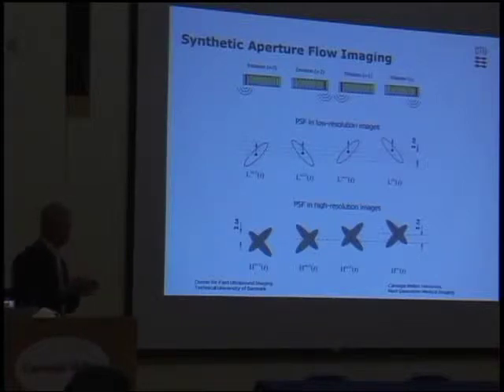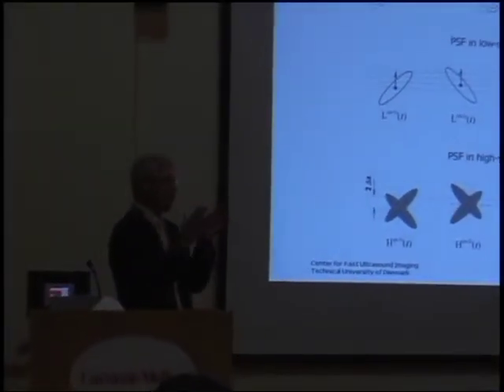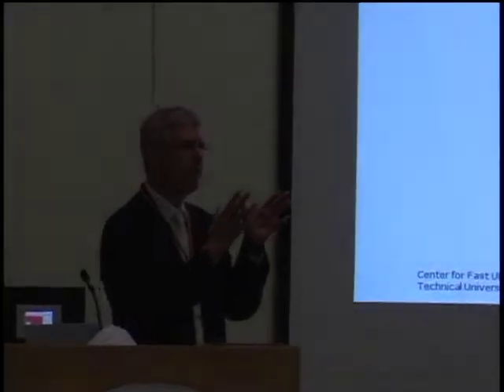The trick here, of course, we thought about this long, and the trick to solve the problem is to ignore it. Because you can find the velocity of a car even though you take it with a long exposure time. If you take two images at a long exposure time the same way and then compare the two, yes, they're blurred, but they're blurred the same way. And that's what we're doing here. So we're just taking a short sequence, reconstructing the image, and then comparing it. And if we compare the same imaging sequence, then we can actually get a velocity out of it.